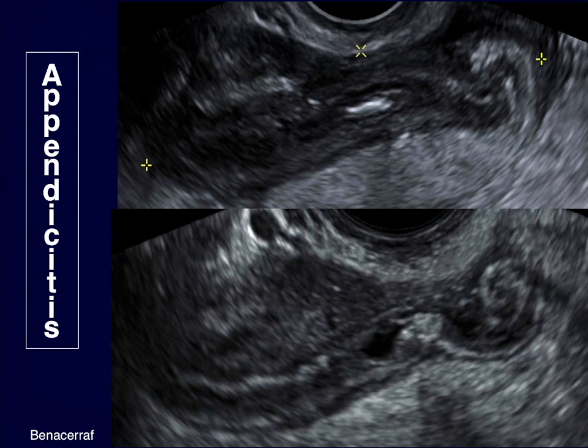Always consider the appendix, particularly if you're dealing with a right lower quadrant pain, because sometimes these will be mistaken for a tube, but they are appendix, and you can see in this case the tip of the appendix all the way out to the tip. It has an appendicolith right here with a shadowing.